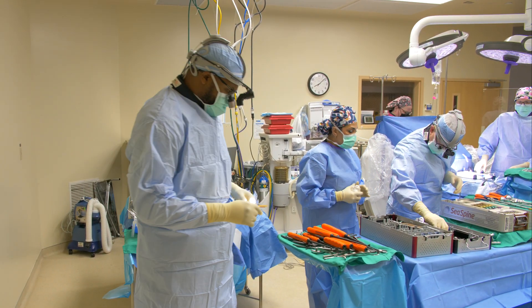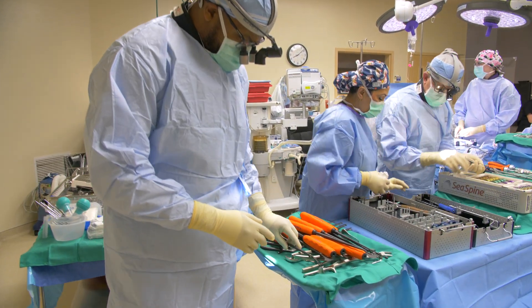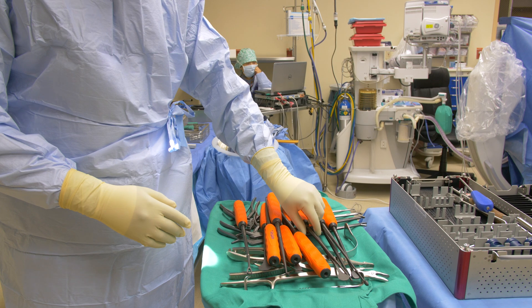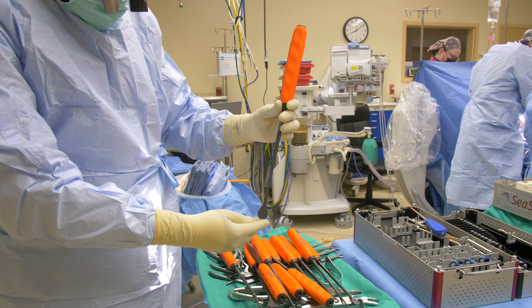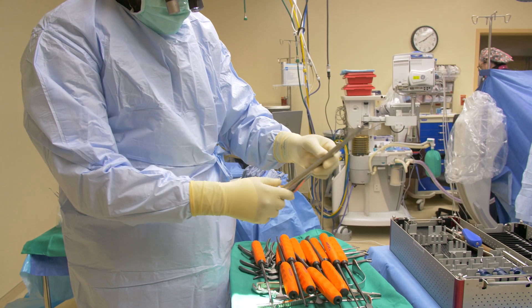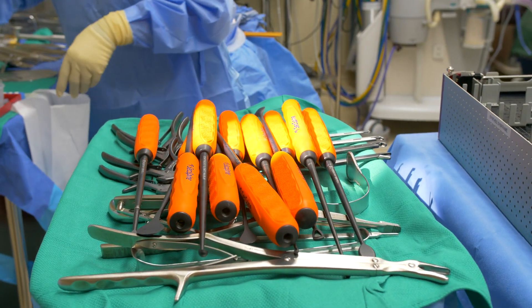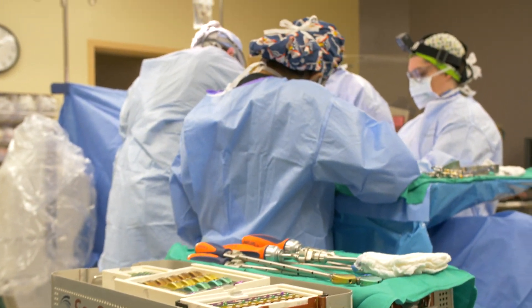Using these instruments today in surgery — this is a curette to clean out the disc space, to get into the corners and clean out all that diseased disc. This is a Cobb elevator that I'll put into the disc space and tap down to clean it out. We have a rongeur here to grab objects in surgery, and some pituitaries and Kerisons here. All our instruments are ready to go to do the discectomy part of the surgery.